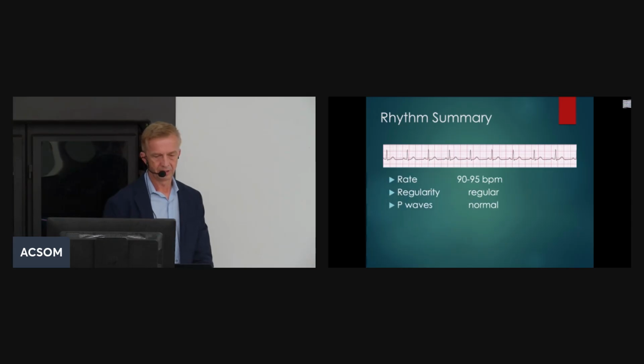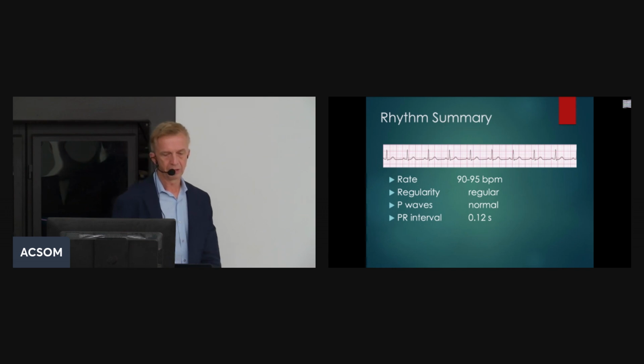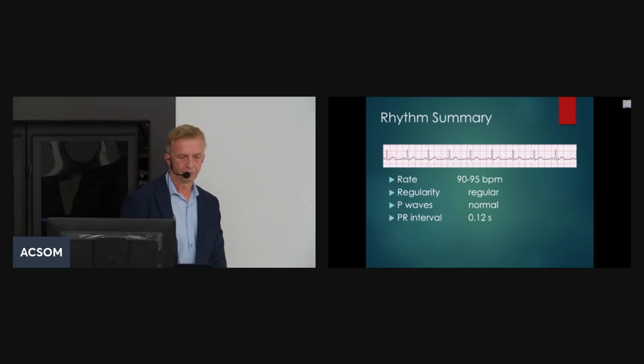All right, so rate, rhythm, regular, irregular, sinus rhythm if there are P waves in front of each QRS complex, and then you should assess the intervals.